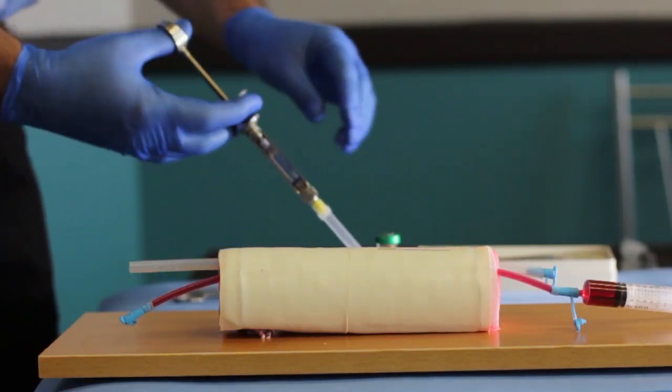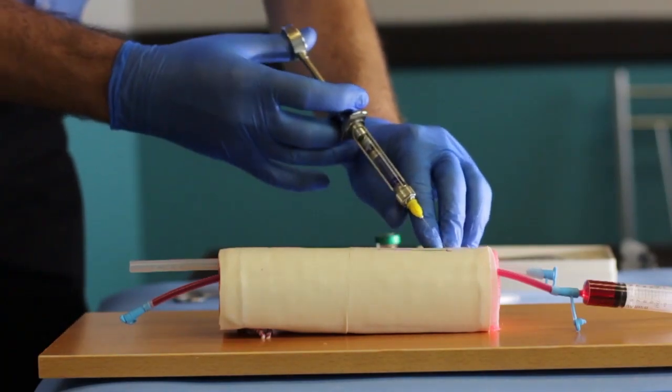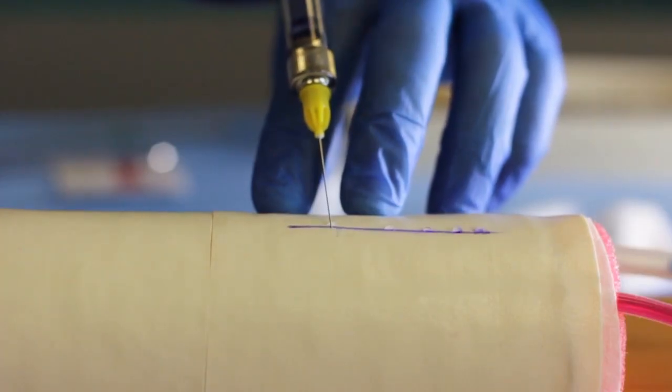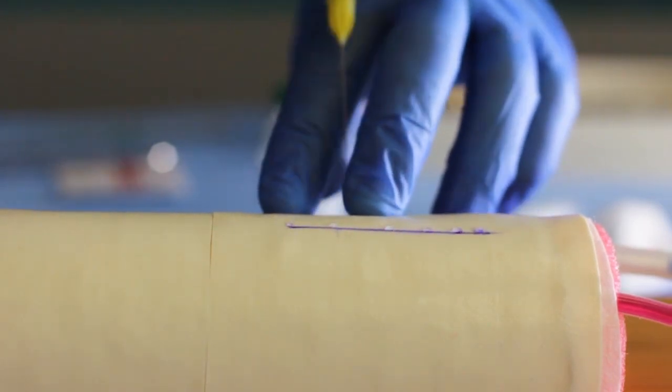Method 2. The materials and items required to do this project are not supplied in the kit. For this method, one uses a thin 27-gauge needle. A dental syringe and needle will work just fine.